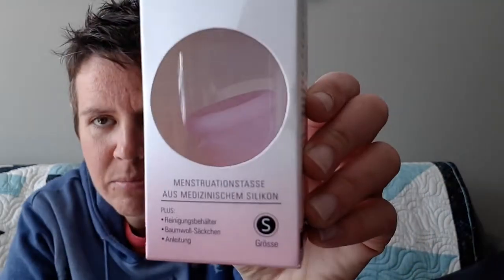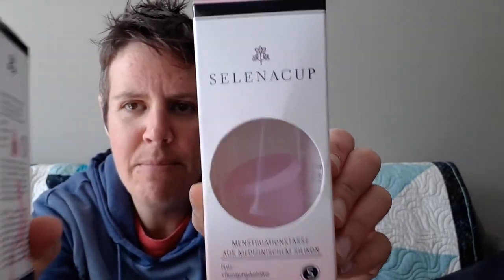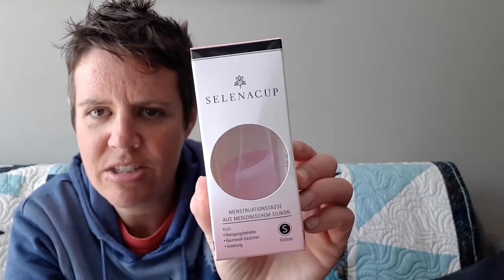Alright, let's get to the unboxing and see what we got. So I have a small Selena cup and also a medium Selena cup. The medium is the active, which is the firmer one, and the small one is just the regular.